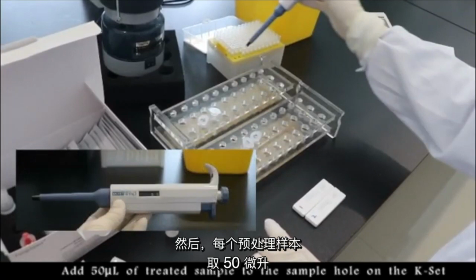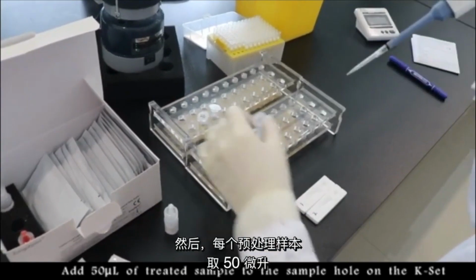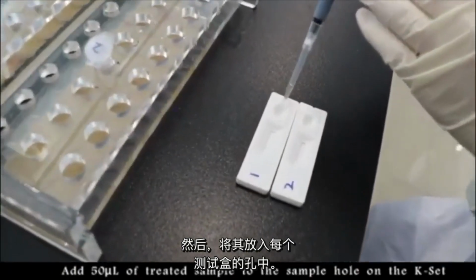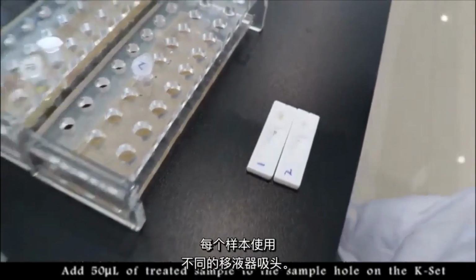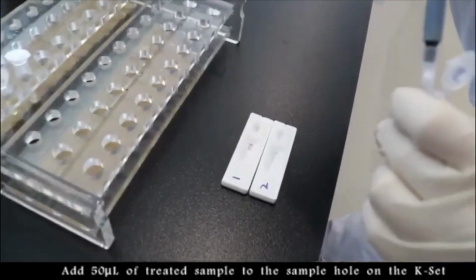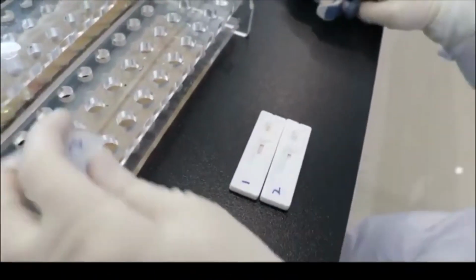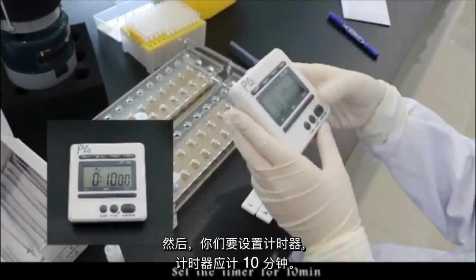Then you take 50 microliters of each of these pre-treated samples and you place it into the well of each of these cassettes. Use a different pipette tip for each sample. You then set the timer and it should read 10 minutes.